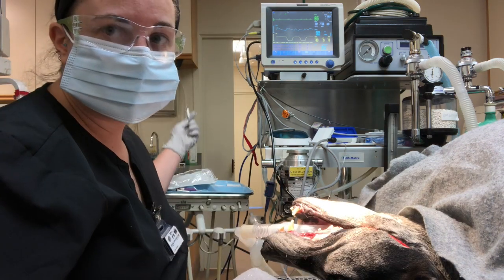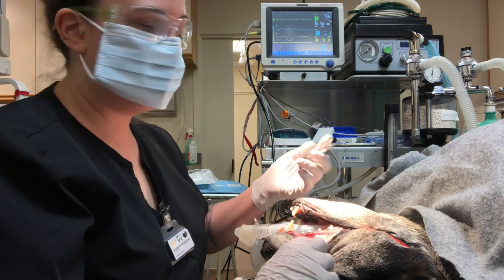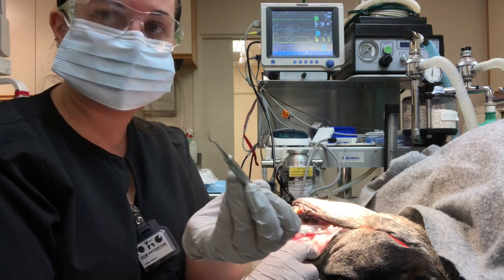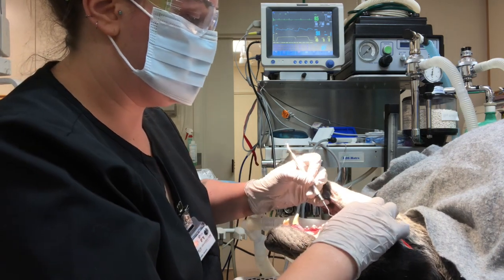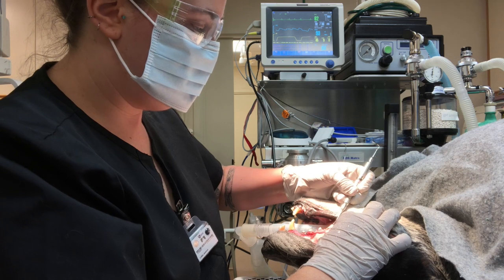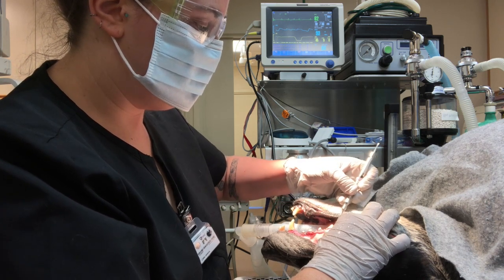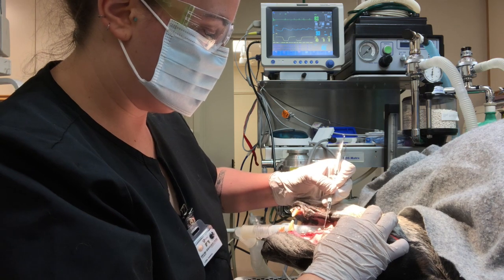For under the gum, we don't want to use the hand scaler because we can really hurt the gingiva. So we want to use our curette instead. So this one has a nice angle that we can get underneath the gingiva and stay with the tooth to help get some of that subgingival calculus away, like so.